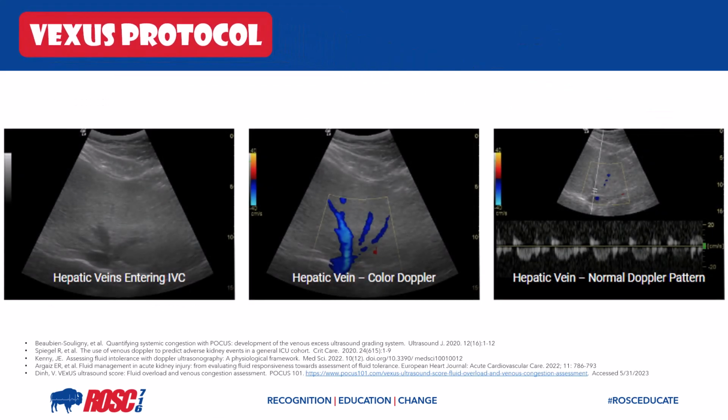Now let's move on to some Doppler assessment modalities that may help us determine fluid tolerance. With that, we're going to start discussing the VExUS protocol. This is venous excess ultrasound grading system.